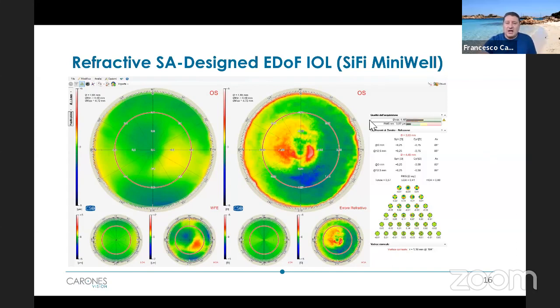You see here how the central part is set to be slightly transferring the light to the myopic side, so giving more on the minus side, while the mid-periphery is more on the opposite side, so giving a little bit of hyperopia. So again, why is it so interesting? Because the combination of these two different patterns actually gives the plano value with a little bit of astigmatism again.